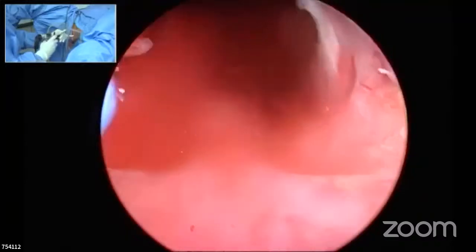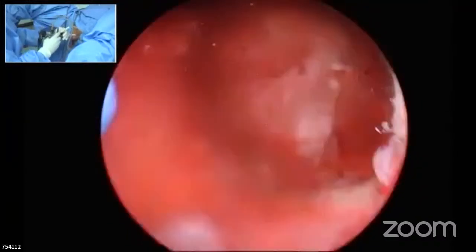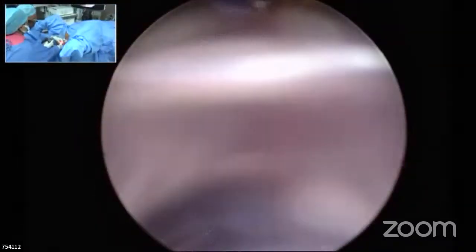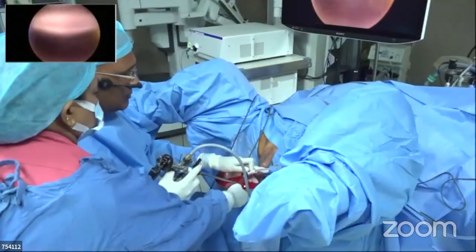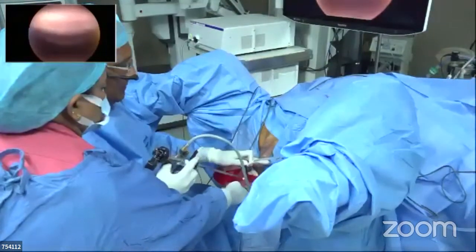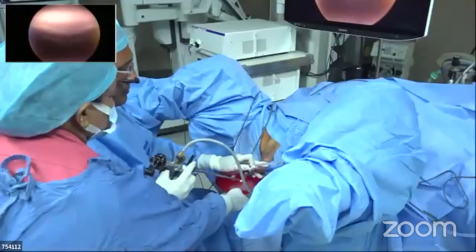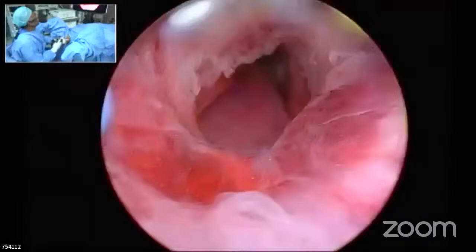I'm clear, sir? Yes. Can I do this, Malik? What I do for the apex is, as you showed that area very nicely, I mark there with my loop, or I make a retrograde cut. So all my residents who have seen me, that retrograde cut I make, so that I know where I am cutting. I don't have to go more distally. So that is where I save the sphincter.